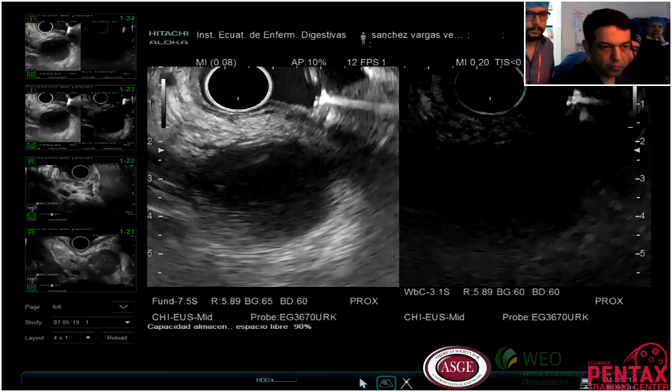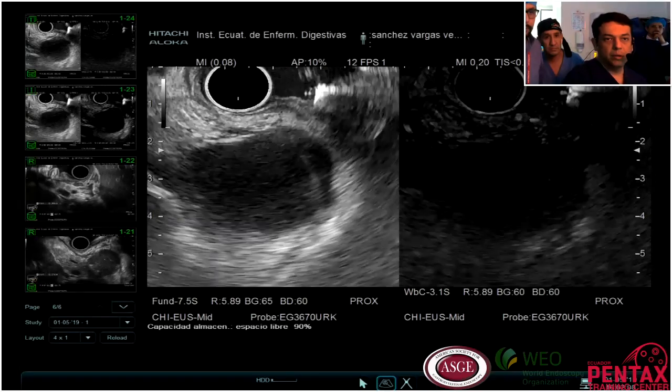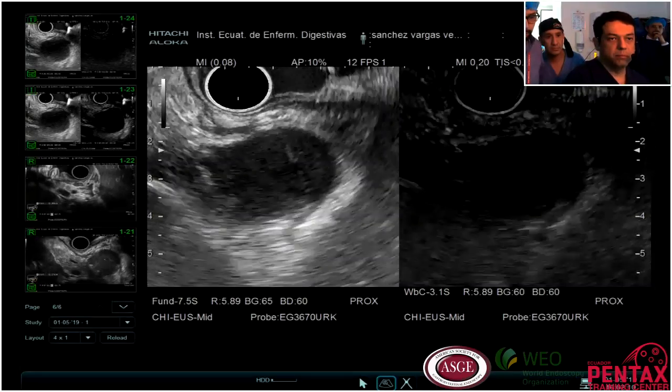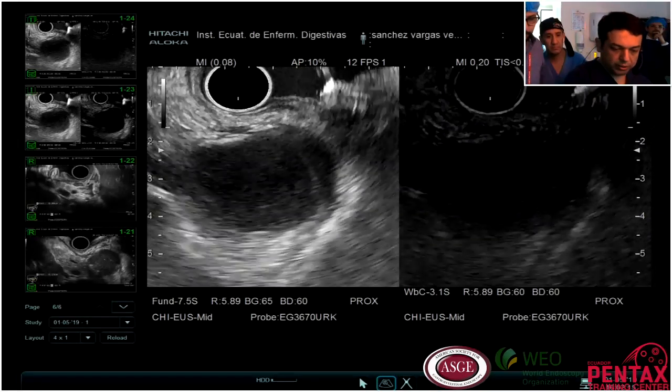Okay. So, one of the big advances of this new machine is that we can do a contrast evaluation.